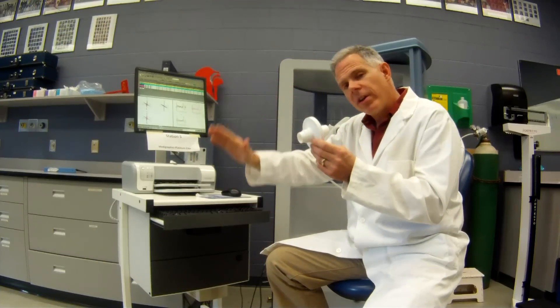With this particular test, there are some other elements. We're going to start off with just nice, even breathing, just letting them get relaxed in the body box. Coach the patients: nice, even breathing, just let them get settled in. Most machines need about four or five breaths at least just to gather the baseline data. Make sure that they're breathing at FRC.